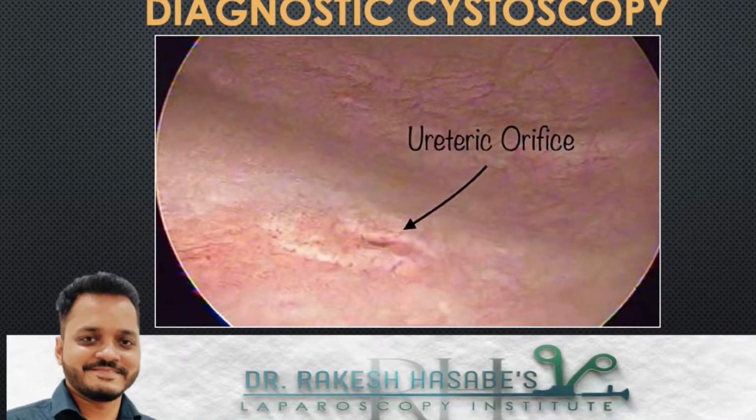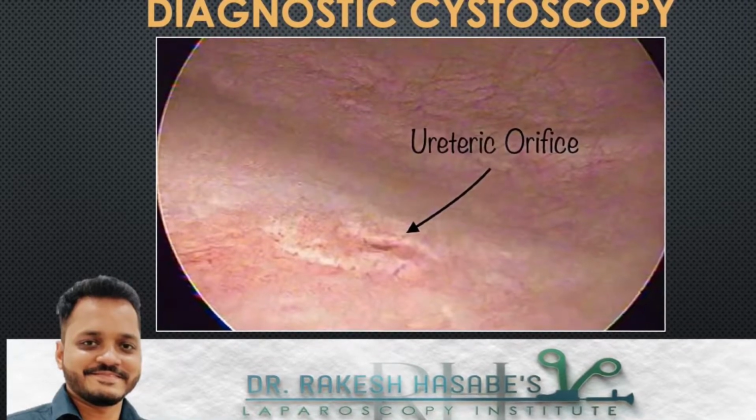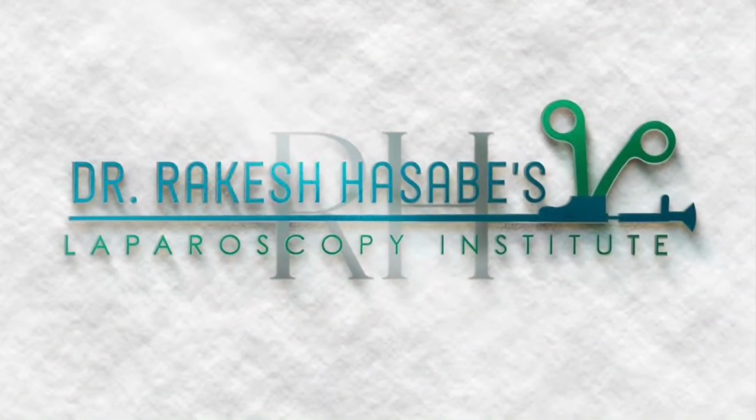Today in this video, I will share tips and tricks to perform diagnostic cystoscopy.